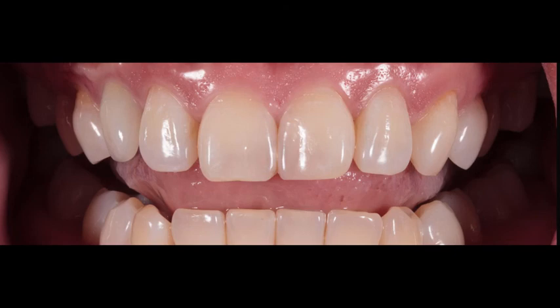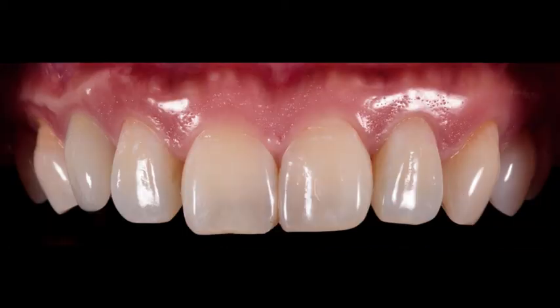Again, ideally she would have needed orthodontic treatment, but she declined, but still we were able to give her a really, really nice smile, maintaining all the papillary form and the gingival margin as well. Now you can see here that the gingival margin is exactly at the correct location, which is 1 millimeter apical to the lateral here in this case, corresponding to the contralateral canine.